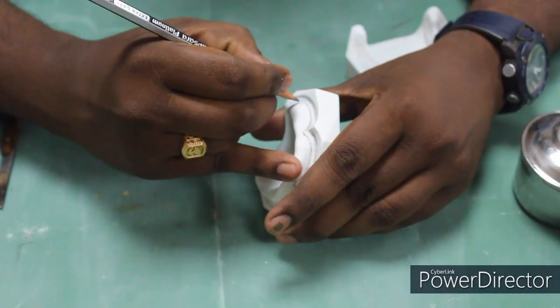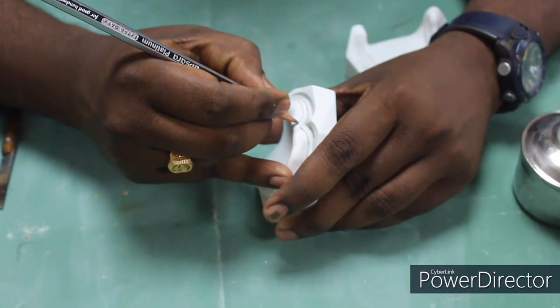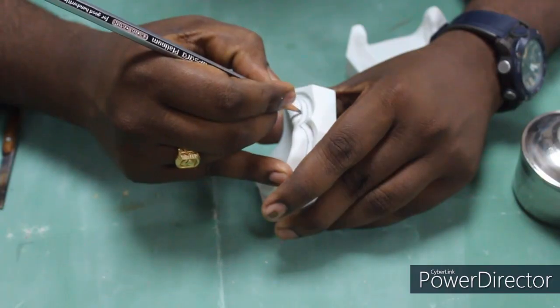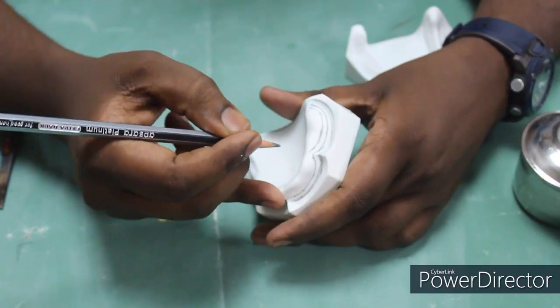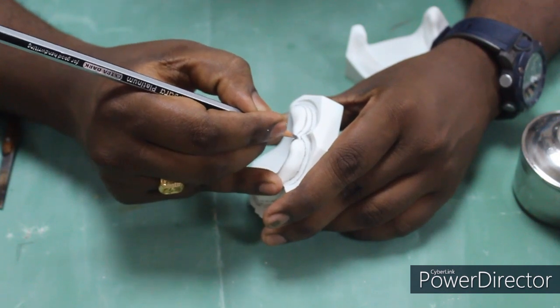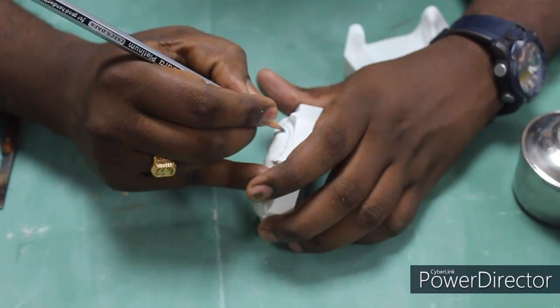So it has to follow the outline of the tray line. Again you have to give a V-shape design in the frenum area to accommodate the frenum.